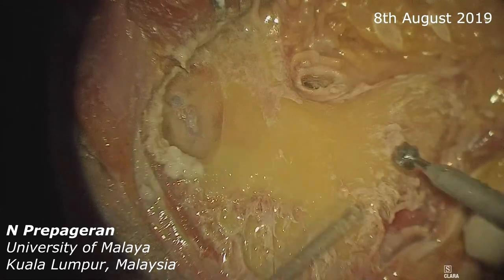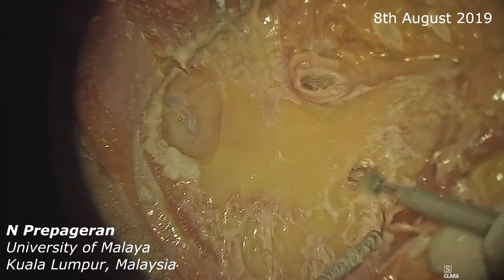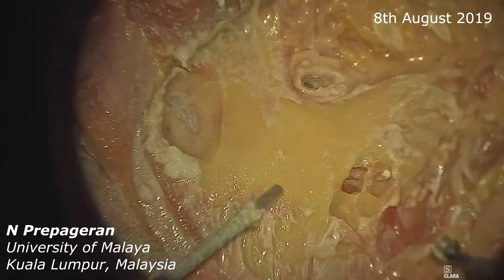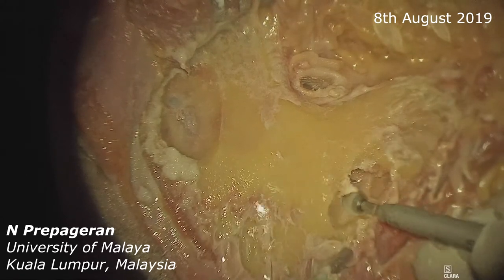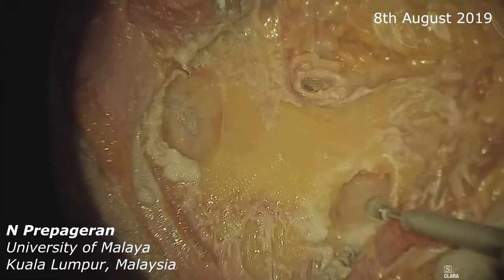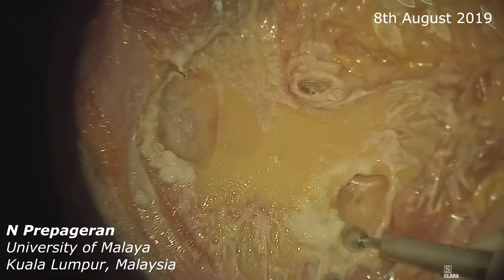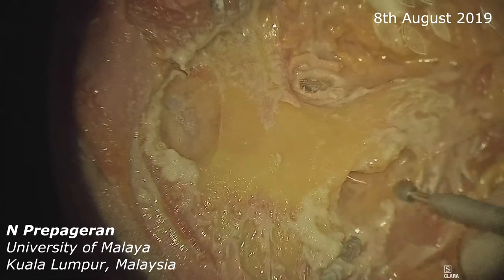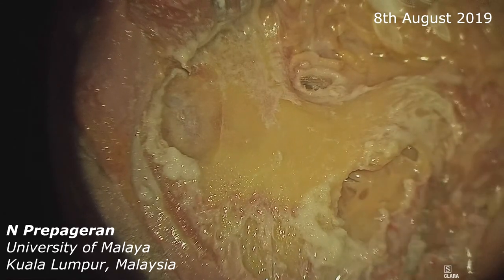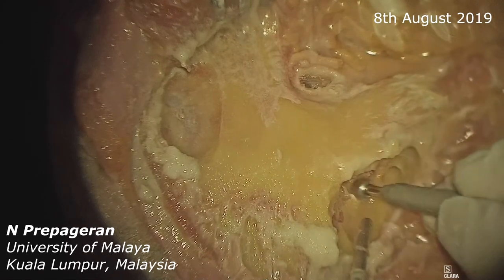There's the middle cranial fossa. So once we have identified the middle cranial fossa, the next one we want to identify is the retrosigmoid. Here you can see we are already in the mastoid tip. So now we are going to drill behind the sigmoid sinus to identify the retrosigmoid region and hopefully the dura that comes with it as well. This seems to be a very pneumatized mastoid, which is good. I can already make out the blue of the sigmoid sinus — that's where the sigmoid sinus is going to be.